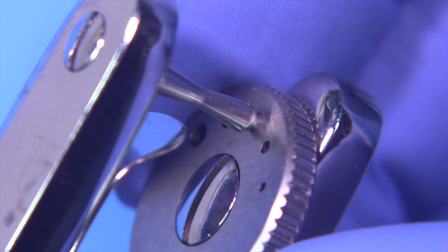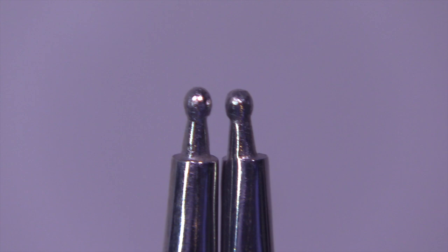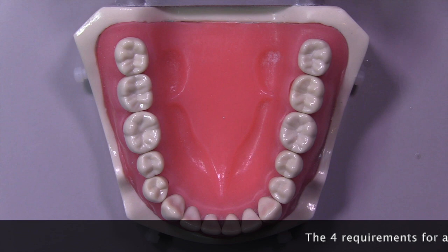When it comes to forceps, this is the Stokes style rubber dam forcep. It's got these little balls on the end and I think it's a decent forcep, but I need to modify it because those internal corners are going to grab hold of the clamp when we're trying to release it. So I like to make this particular modification so I can get the clamp out easily.